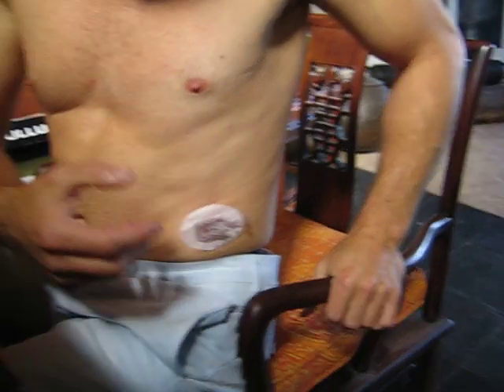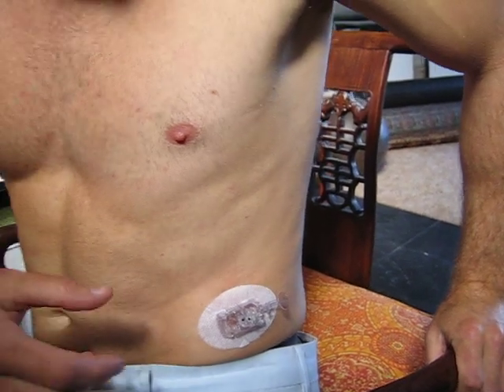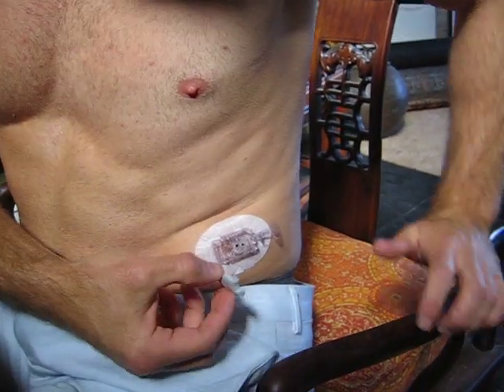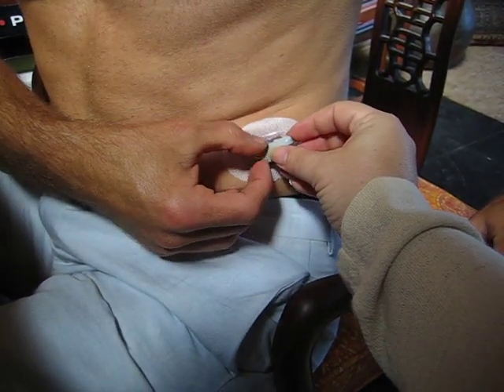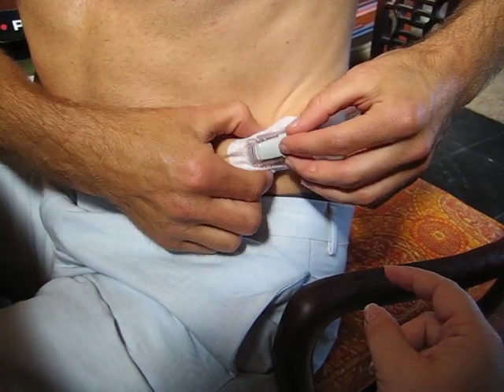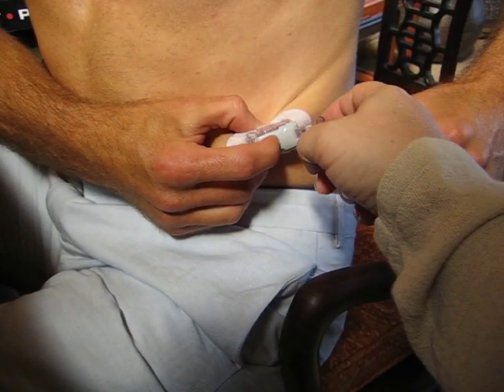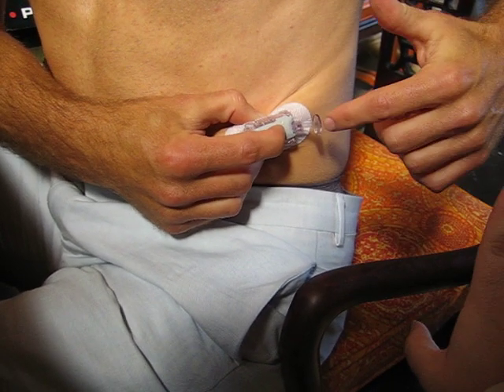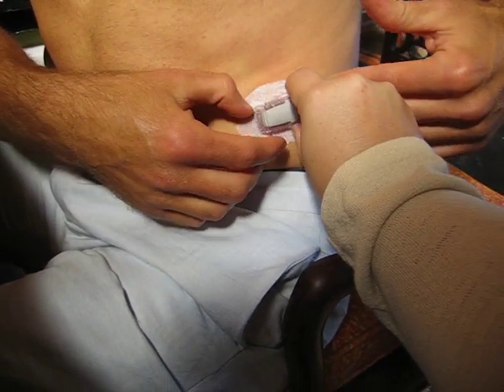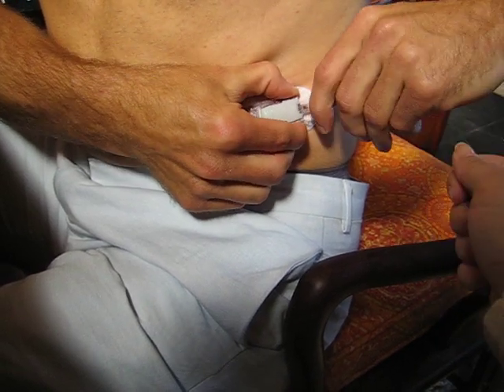Now the transmitter gets placed on top of that. Place the transmitter like this, then pinch up a little bit on your skin to make it a little tighter. Put a finger here so it holds it in place. Then take this latch and lock it forward — you're going to hear two clicks. The latch goes back flat. Hold the plastic here with this hand, then twist that latch right off — just twist down or up and break it off.